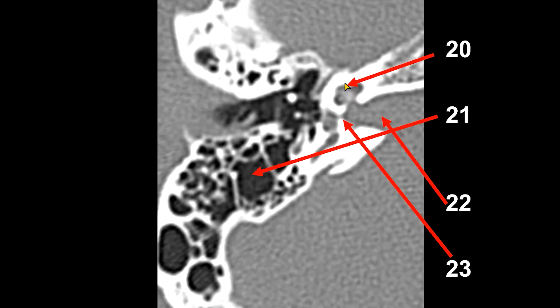Number 20 here is a portion of the cochlea — we're cutting through the apical turn of the cochlea, and this is the middle turn. On a previous slice we saw the basal turn, giving us all three turns: basal, middle, and apical. This area nicely demonstrates the cochlear aperture — the opening leading from the internal auditory canal to the cochlea. The small amorphous hyperdensity within the cochlea is part of the modiolus, effectively the skeleton of the cochlea. Number 21 points to the mastoid antrum and some mastoid air cells.